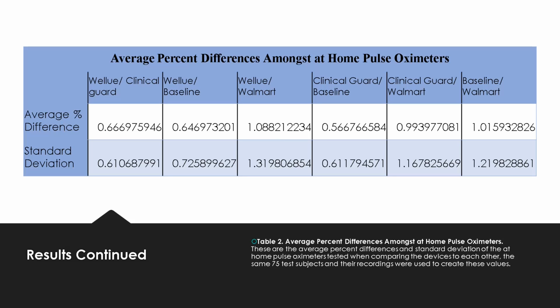We also compared the pulse oximeters tested to each other by looking at the percent differences between the samples among the different pulse oxes. As it can be seen, the ones with Walmart show a higher percent difference between samples. Since we used an old monitor and the standard that we actually considered might have been inaccurate, it is important to take a look at this and see that the Walmart one shows a significant difference compared to the rest of them in terms of being less accurate.